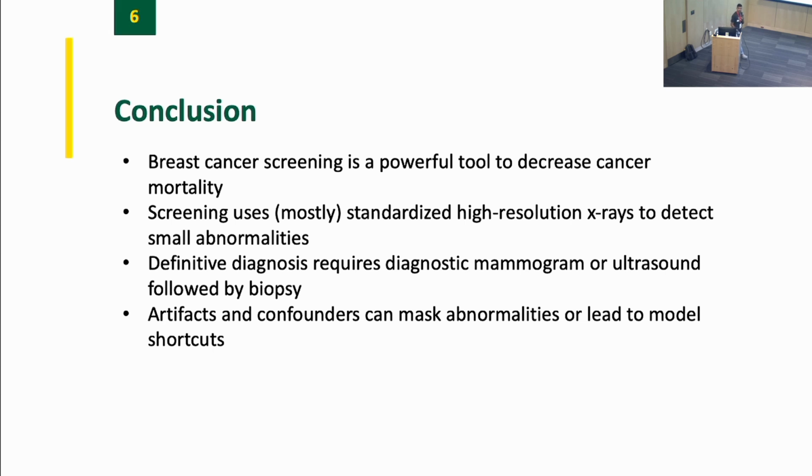The signal to noise ratio varies depending on the device we're using. Yes, some devices may be noisier than others, but on average they're held to very high standards, like MQSA standards. There's a certifying body that certifies the devices themselves, how often they're calibrated, and how often they're checked. You have to calibrate them with phantoms with known density, known tissue, and known abnormalities. The monitors have to be calibrated and checked too, right? So the signal to noise is not in the traditional sense of digital signal to noise. I mean it more in the sense that cancer is really tiny, like a needle in a haystack, which is probably more accurate.